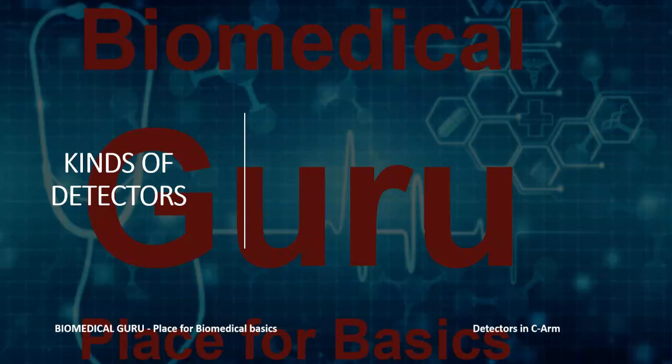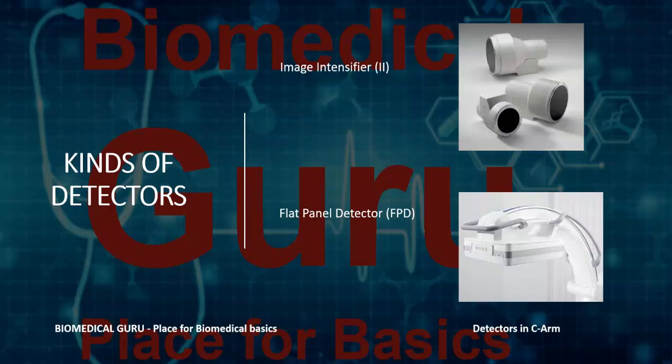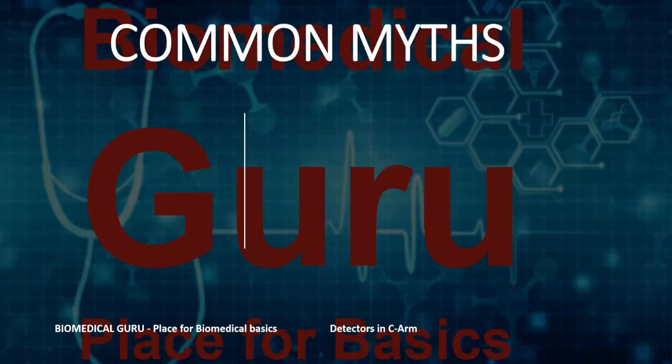Today we're going to discuss the different kinds of detectors that are used in surgical C-arm systems. The first variant is the image intensifier, which is a time-tested technology that has existed for more than 25 years. Very recently, we've come across flat panel detectors also. This has raised a concern among clinicians as well as biomedical engineers about which detector is better for whom and why. This video clears some of the doubts all of us have.